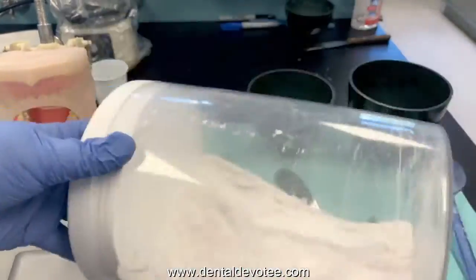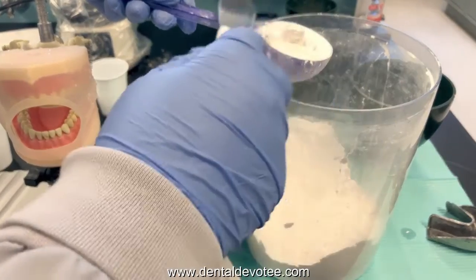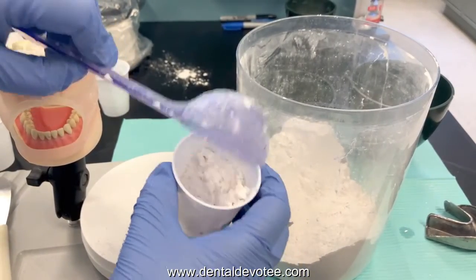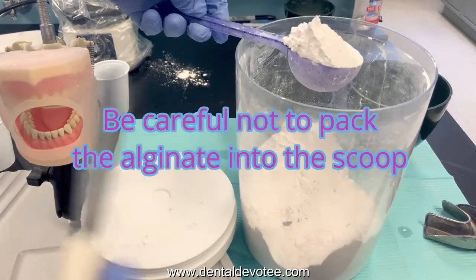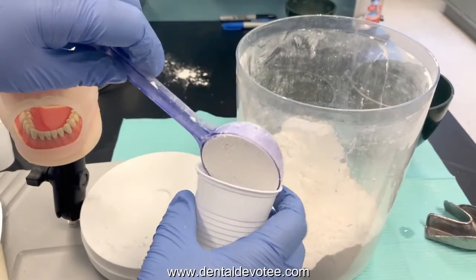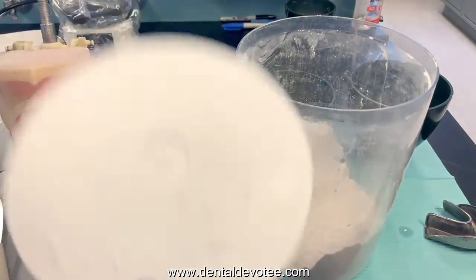Fluff your powder — roll the container around to fluff it, per manufacturer's instructions. Take a fluffy scoop, level it off, and transfer it into a cup until you're ready to mix. Take another scoop, level it off, and put it in the cup. Alginate is affected by humidity, so you don't want your powder sitting out exposed to air for too long. Always recap your canister of powder.